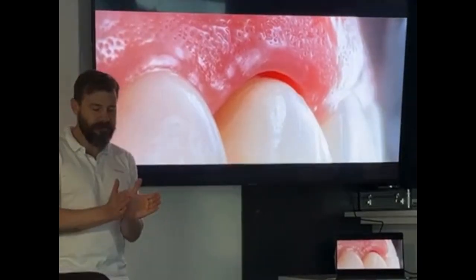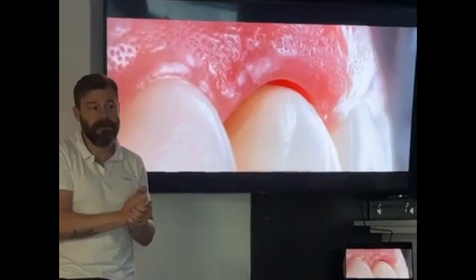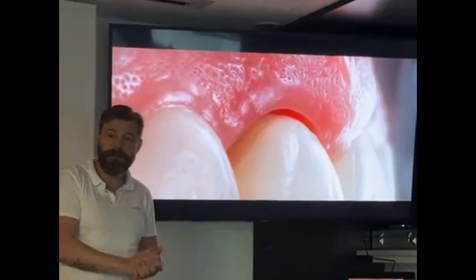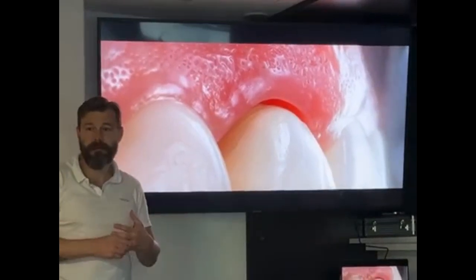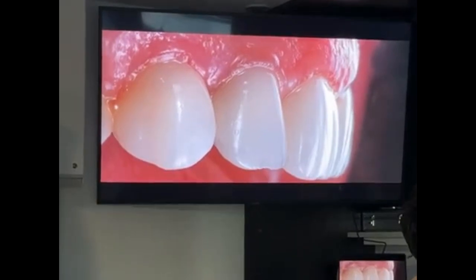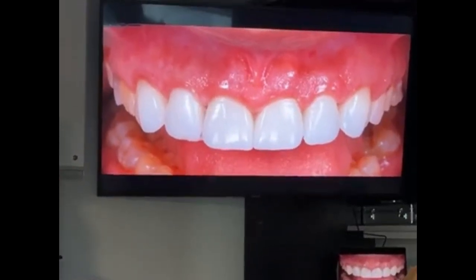So when I started to really understand how to copy and paste the provisional design and give this information right to my technician, the prosthetic part, I really enjoyed doing that. I used to enjoy it a lot because nowadays I focus much more on the surgery, but that is a good way for you to not have stress in the workflow. There's no surprise because you really control all the steps, right? So this is the final arrangement, lateral view, the front view, beautiful architecture here, completely preserved. I think much better than our own, right?